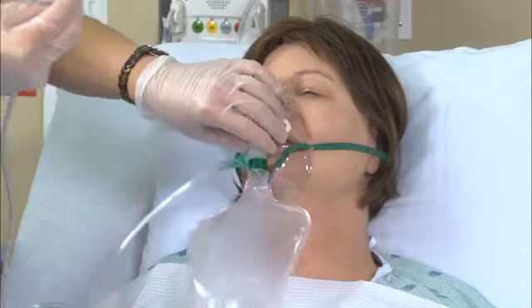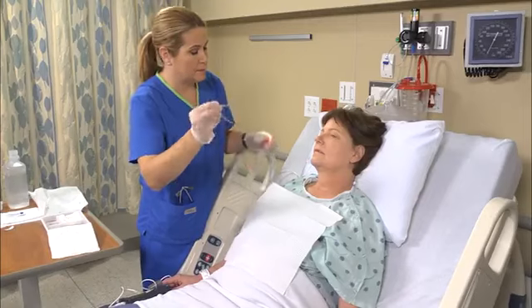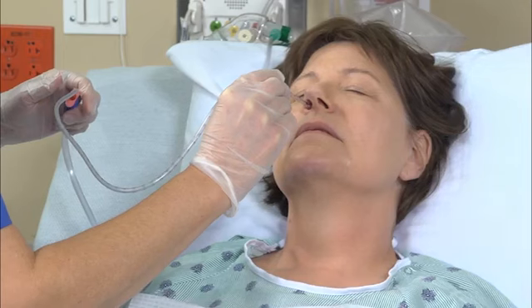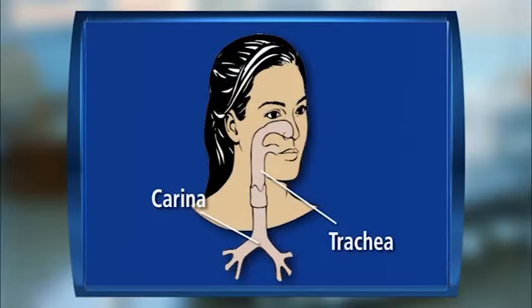Using your non-dominant hand, remove the oxygen delivery device. Ask the patient to inhale deeply. Use your dominant thumb and forefinger to insert the catheter gently but quickly into one of her nares as she inhales. As you insert the catheter, do not cover the catheter vent. Follow the natural course of the nares. Orient the catheter downward slightly. Don't force it. If you feel resistance, you've probably hit the carina. In that case, withdraw the catheter 1 to 2 centimeters, between 0.4 and 0.8 inches, before applying suction.